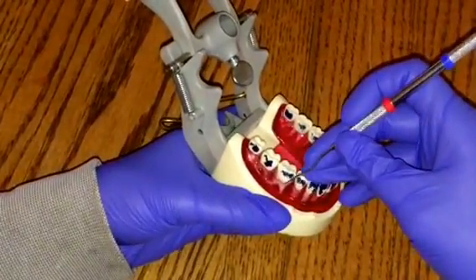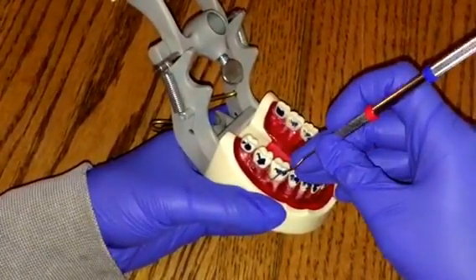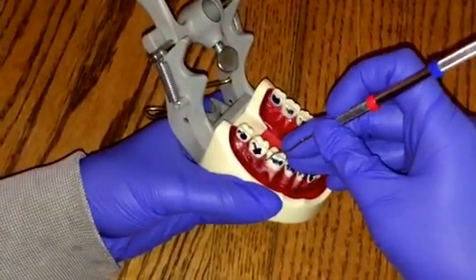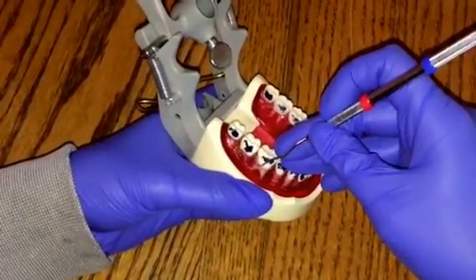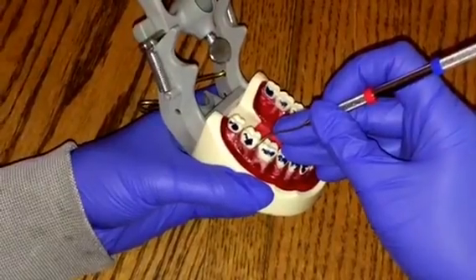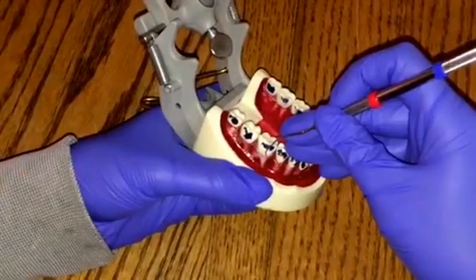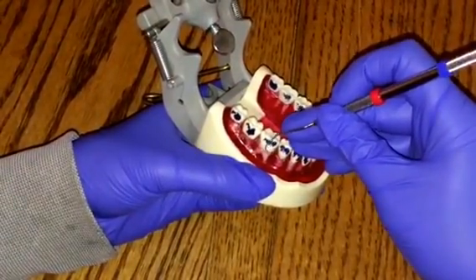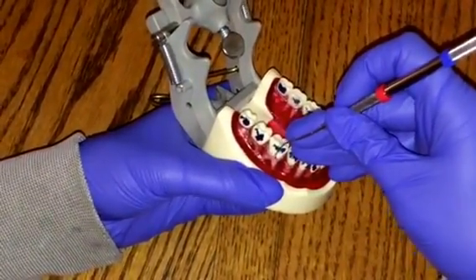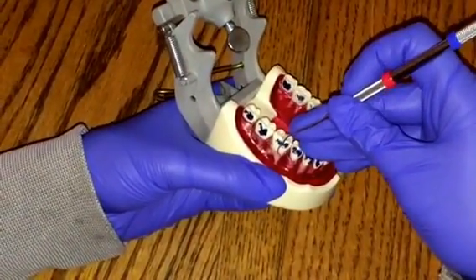I first want to start mesial to the distal facial line angle, standing up on my fulcrum, moving distally using a sweeping motion, going into that col, feeling for the calculus, and backing out. Then I want to turn my end around, start distal to that distal facial line angle, stand up again on my fulcrum, go mesial, stand up on my fulcrum, and go back, starting distal to that distal facial line angle, standing up on my fulcrum, going into that col, feeling for the calculus, and safely backing out.